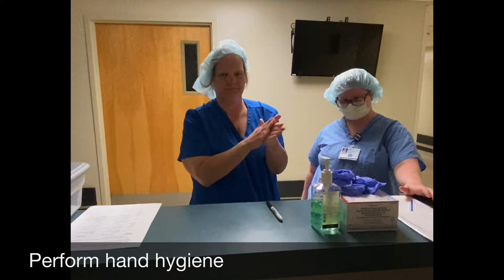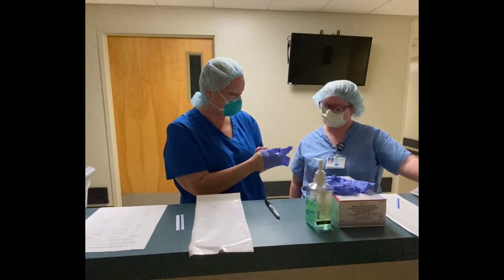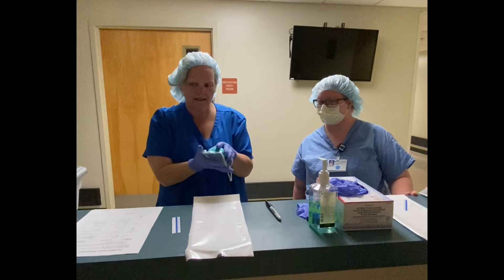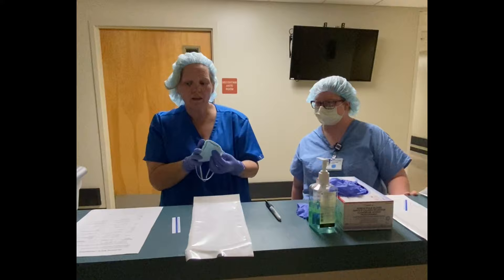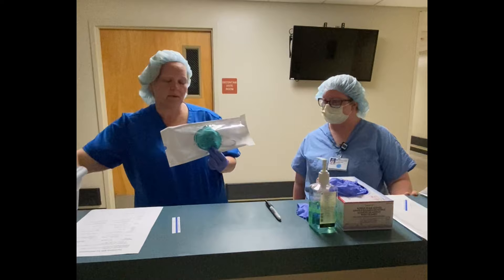First, we're going to doff the mask. Key point number one: don your gloves, and that's to keep you safe. Remove your mask in a safe and controlled manner — that also helps to keep you safe. Key point number three, perform a visual inspection, because soiled or damaged masks have to be discarded. Important step number two, place the mask in the Tyvek pouch — the outside of the mask has to be showing through the clear plastic.